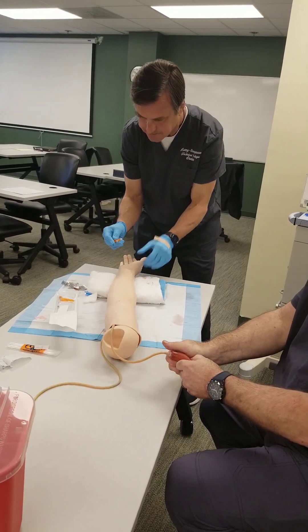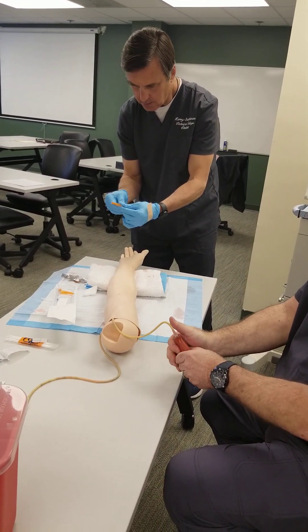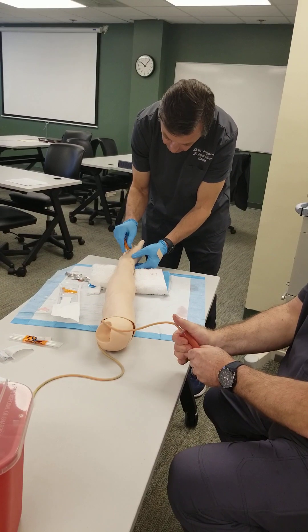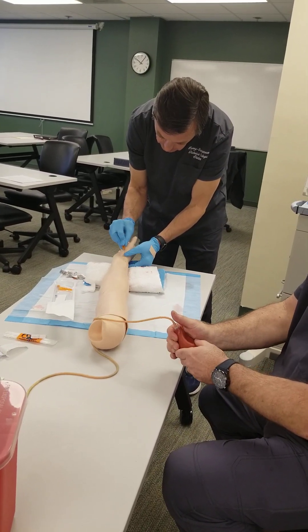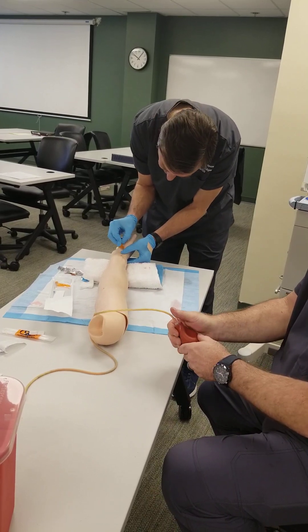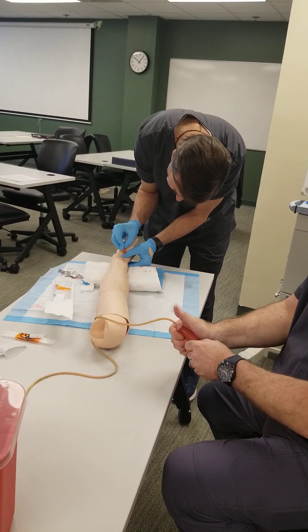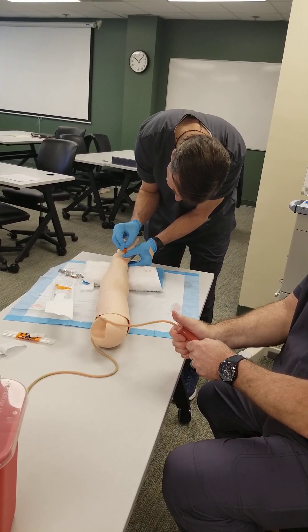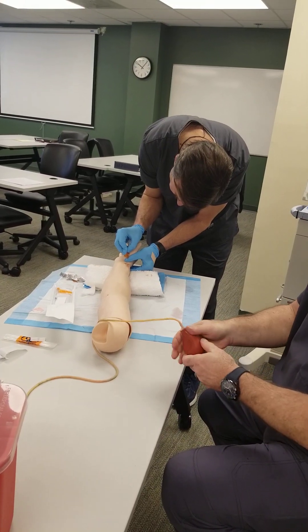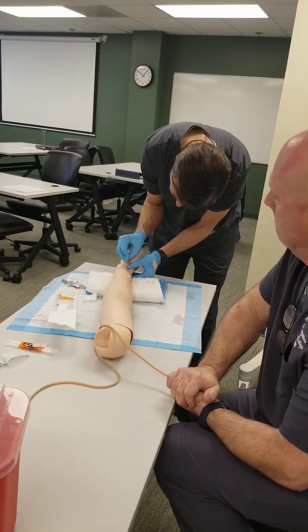I'm going to slowly insert the needle bevel up at a 45 degree angle. I'm holding it like a pencil. Go ahead and slowly stick and watch for the flash — and there's the flash. So it's filling up now. I'm going to wait until I get the required amount.